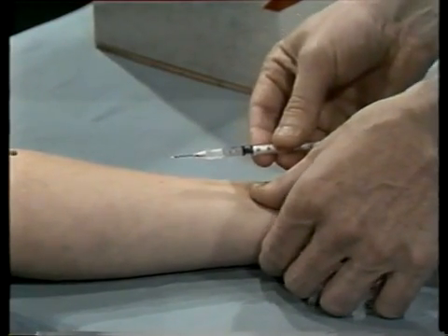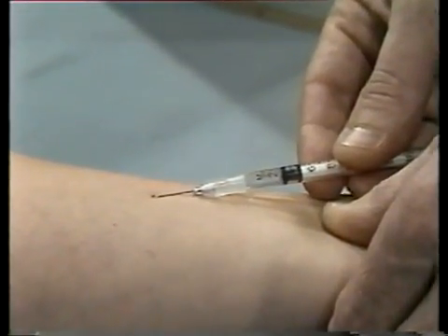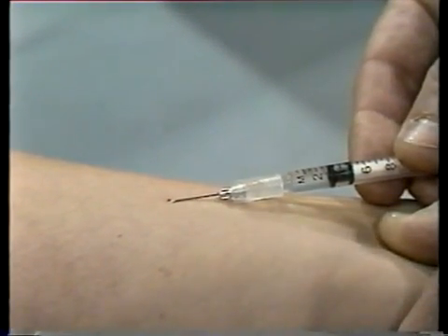Next, stretch the skin tight across the forearm at the injection site. Hold the syringe so that the needle is at a flat angle, almost parallel to the skin — about 15 degrees.